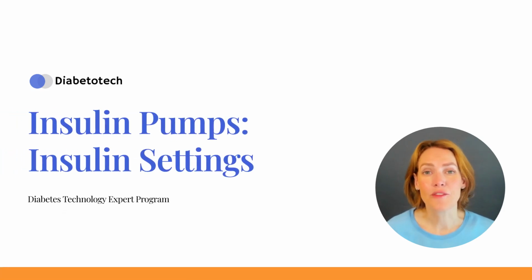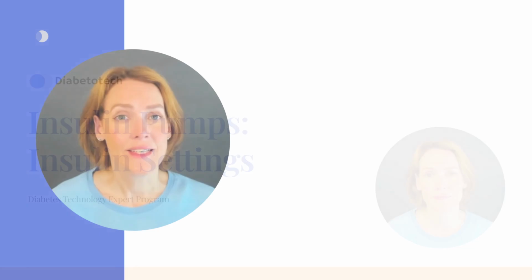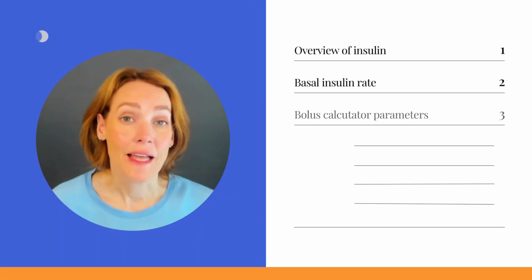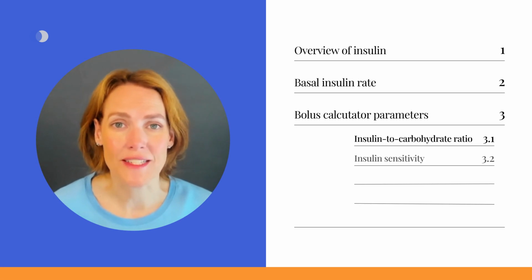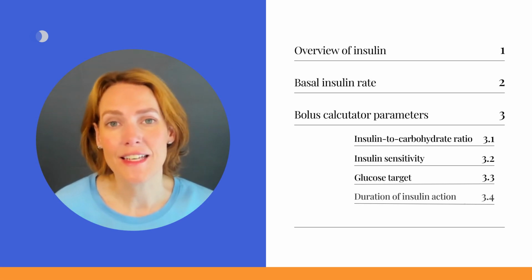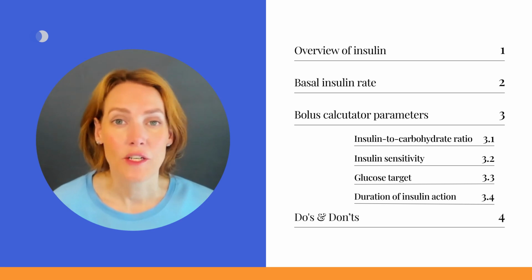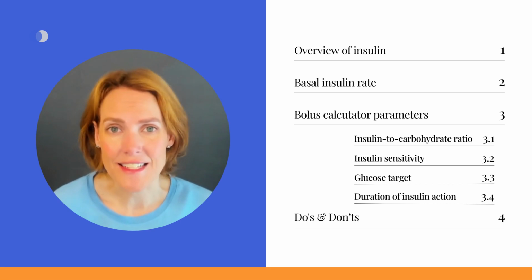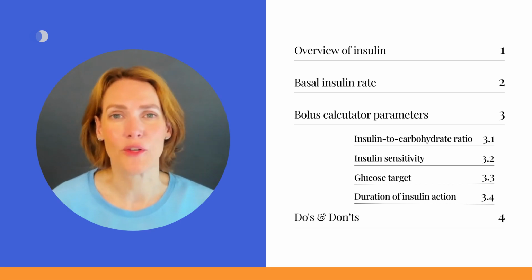Welcome to this comprehensive video about insulin pump settings. An insulin pump offers an intricate way to deliver insulin. It allows you to control both your basal and bolus insulin levels with only short-acting insulin. In this discussion, we'll explore the various settings and how to set basal and bolus insulin settings as you switch from insulin pens to a pump.